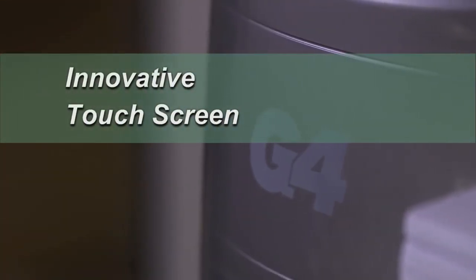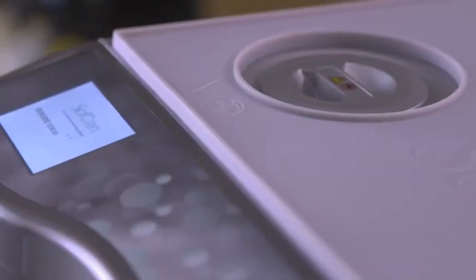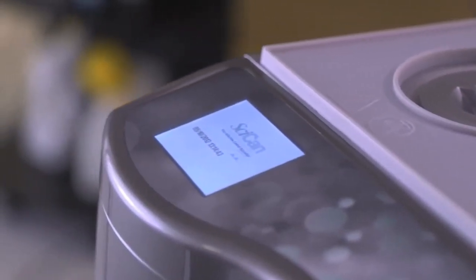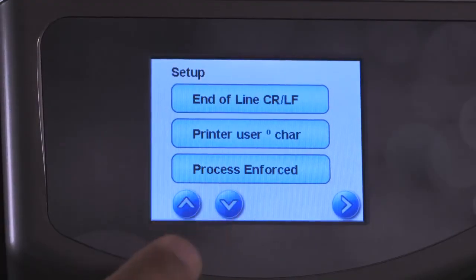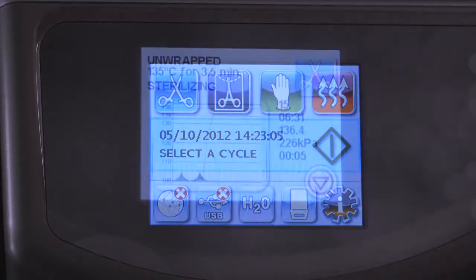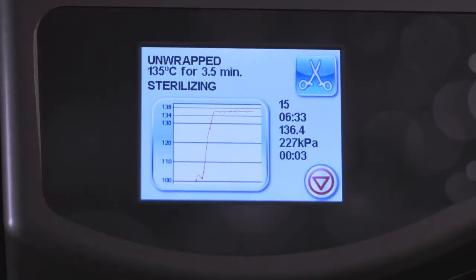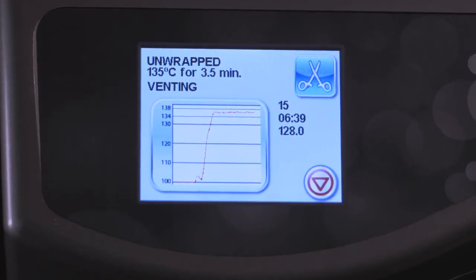With features like these, you would expect an innovative user interface, and the Statum G4 delivers. A new, large, 3.5-inch, high-resolution touch screen offers a vivid display for all G4 operations and options, with a status bar at the bottom to immediately tell you if attention is needed. A live-action graph shows the sterilization cycles in progress, a feature that enables office personnel and service techs to view the cycles remotely.